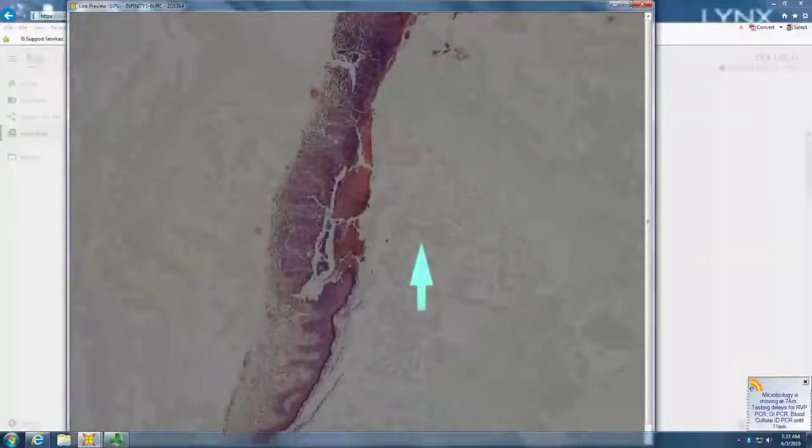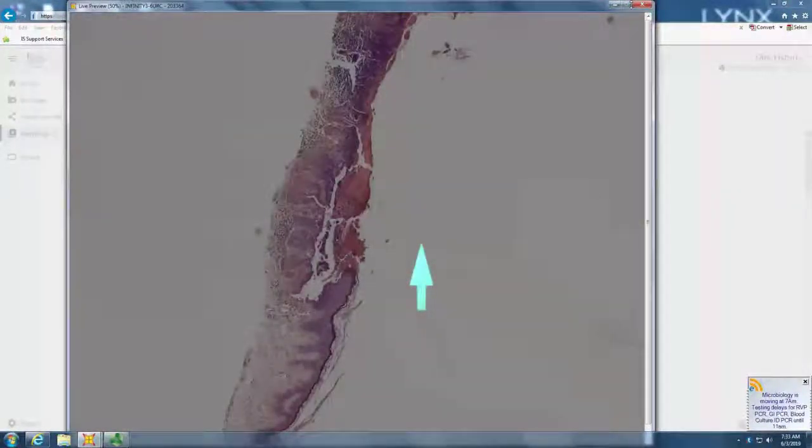If this is a solitary lesion that was ruled out squamous cell carcinoma, then probably warty dyskeratoma. And if the patient has V-nicking and red and white stripes in their nails, Darier's. So it's an acantholytic dyskeratotic disorder, which includes the spectrum from Darier's disease to warty dyskeratoma.